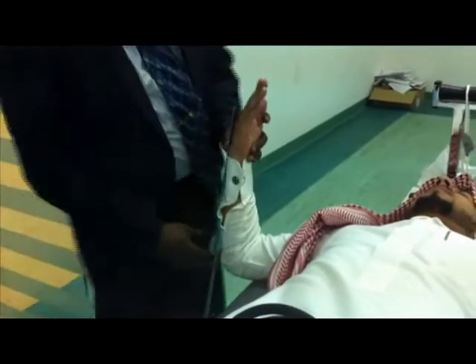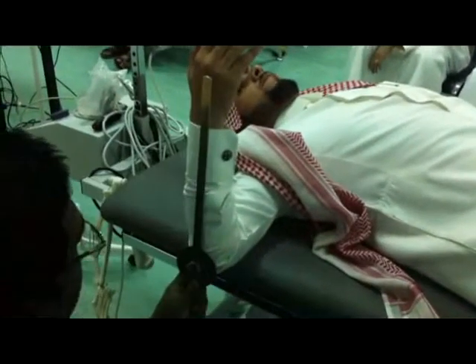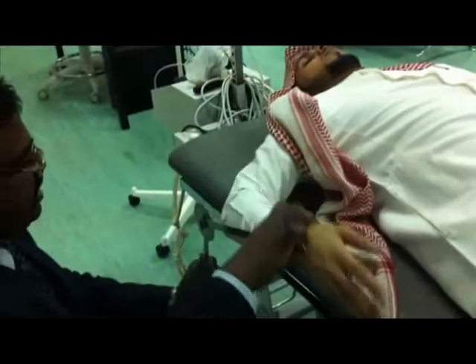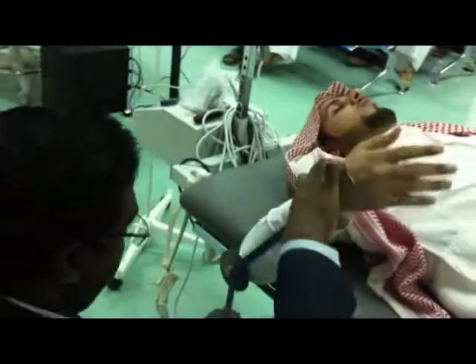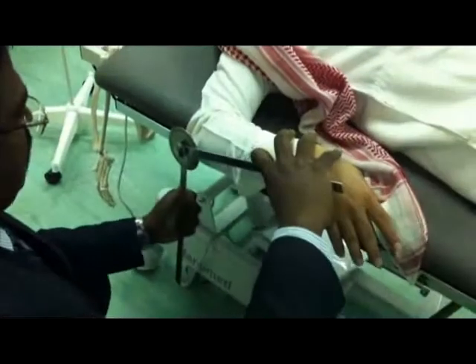Mobile arm is parallel to the forearm — the mid of the forearm. Fulcrum: olecranon process. Stable arm is perpendicular to the floor. Now move the hand downwards — this is internal rotation. From 0, I am going inwards. It went from 180 to 110, that means 70 degrees of internal rotation.